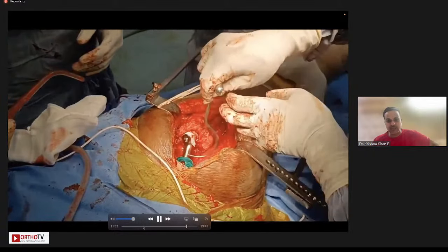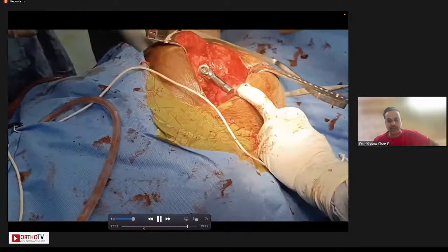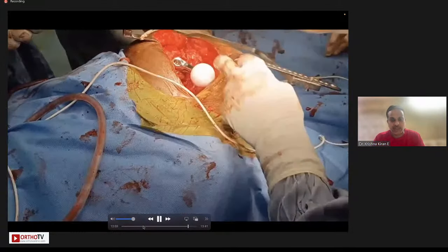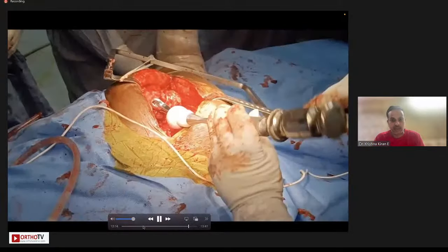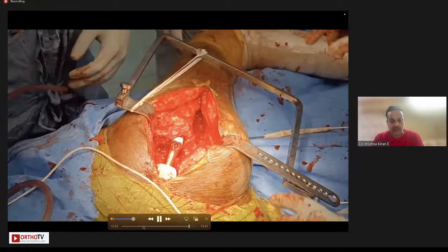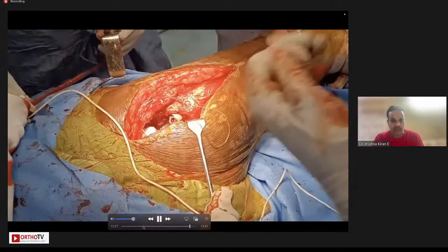So once that is done, you put in your definitive head, and if there is an abductor deficiency or a trochanteric avulsion which was there before surgery in this patient, you will need to repair that particular thing down either with wires or with Ethibond or FiberWire, whatever is the preferred method of fixation for the individual surgeon. And this is again important to optimize. So here we are using the suture material to tie the abductor down through transosseous sutures.